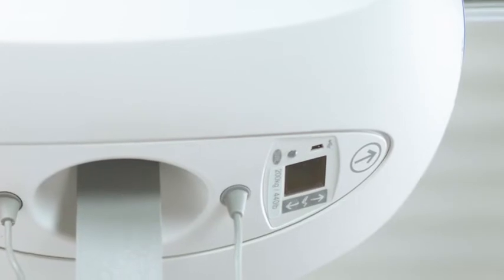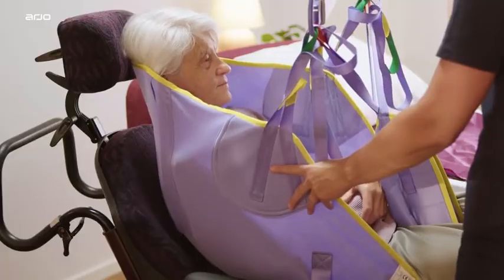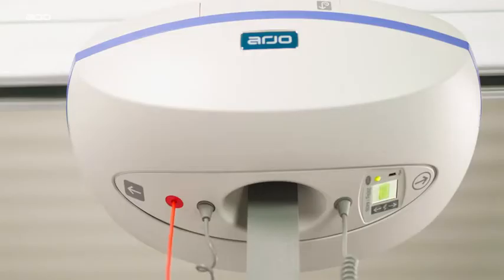Emergency lowering mechanism. In the unlikely event of an abnormal situation, for example, an electrical failure, the emergency lowering mechanism provides a safe way of getting the patient down onto a chair, bed, or wheelchair. The emergency lowering mechanism is to be used only in case of an emergency. Pull the red emergency stop cord.